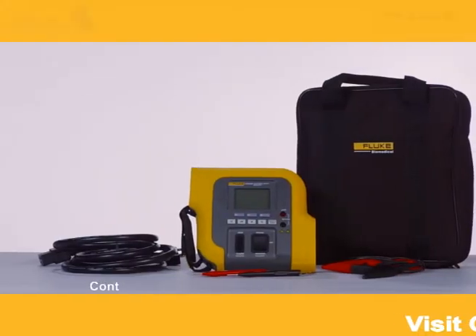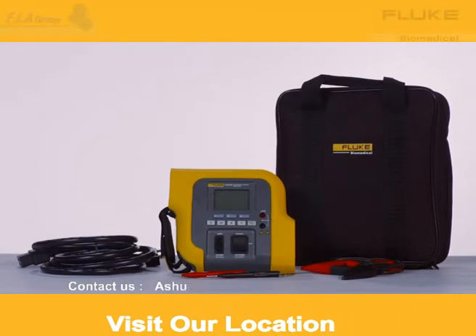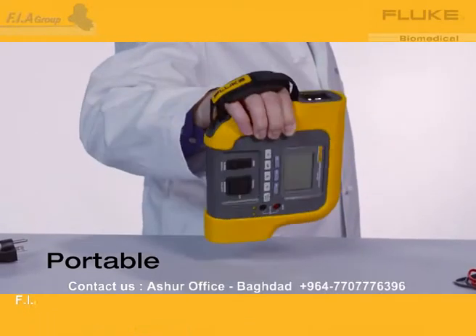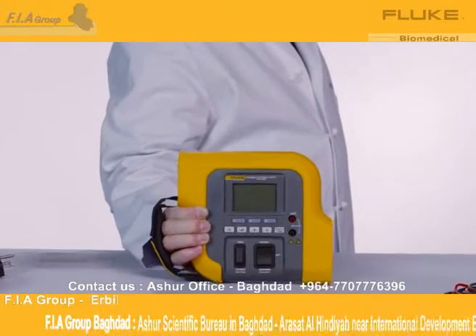Introducing the Fluke Biomedical ESA-609 Electrical Safety Analyzer. It's portable, durable, and easy to use. You'll quickly notice the size of this analyzer. With the weight of only a pound and a half and a convenient hand strap, it's one of the most portable analyzers in its class.